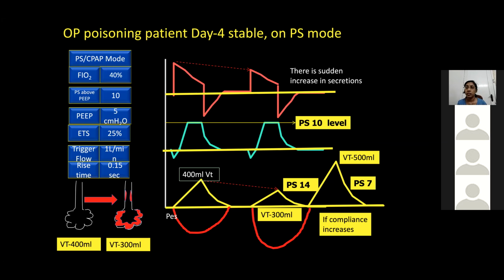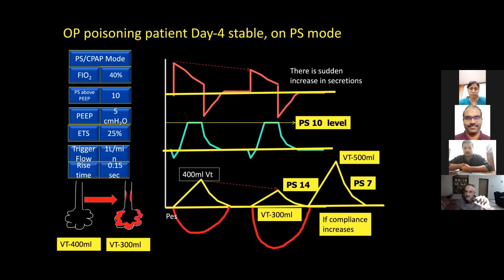Not that anything different to the patient will happen. It will give more comfort to the patient, more safety to the patient, and you may go for earlier liberation, isn't it? Standing in front of a ventilator 24/7 is not possible. So we have innovated newer modes where the pressure support changes when we give a target of 400 and we give a range of pressure support to operate. That is your PRVC or volume support or mandatory rate ventilation or mandatory minute ventilation.